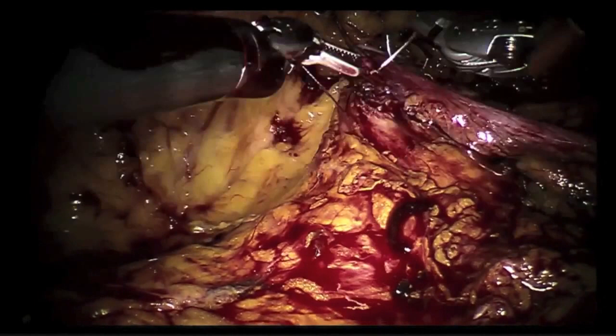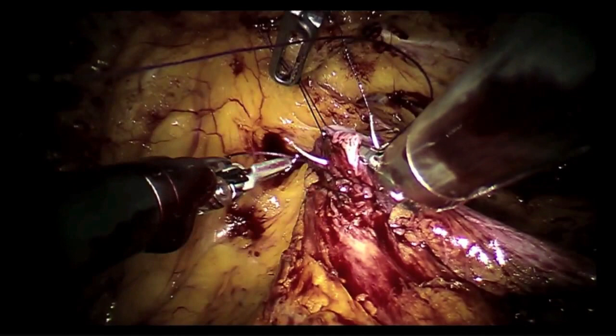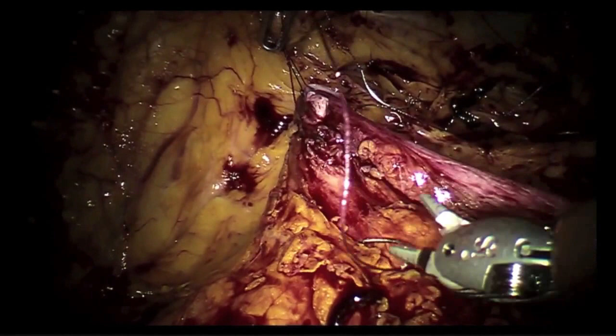And we've got this down. I personally think the learning curve is short. Of course, given that you have enough experience in general. But this should really be done only by people with transplant experience, et cetera, because this is a very non-forgiving operation.